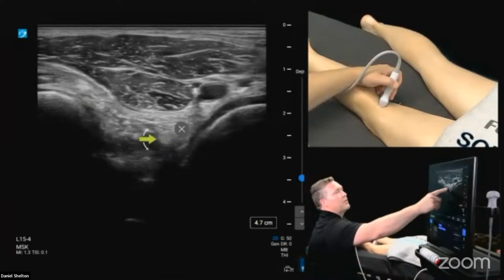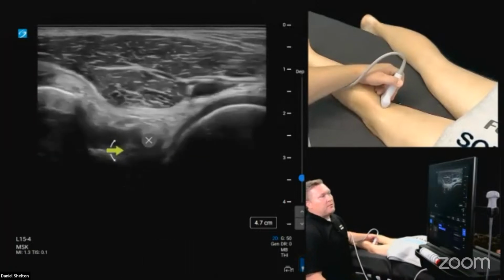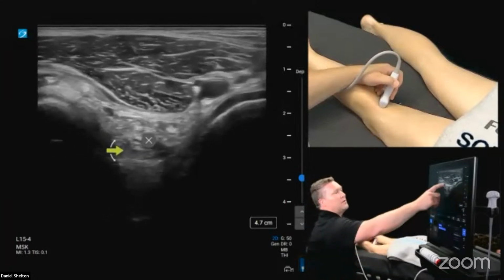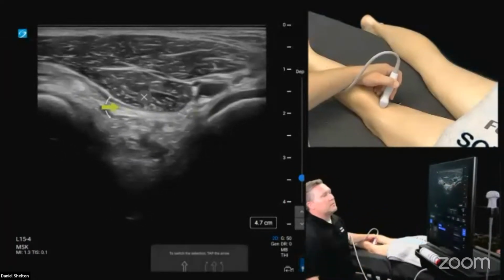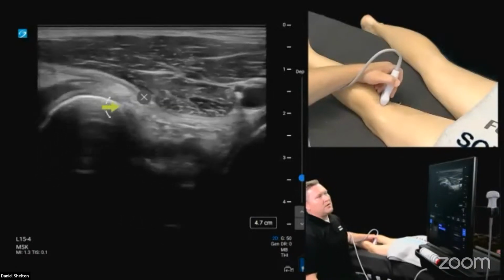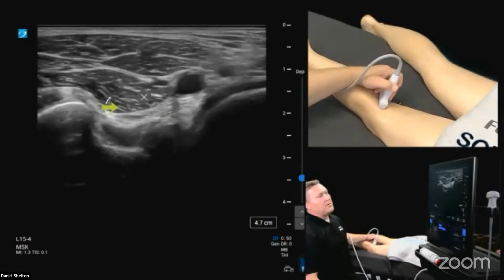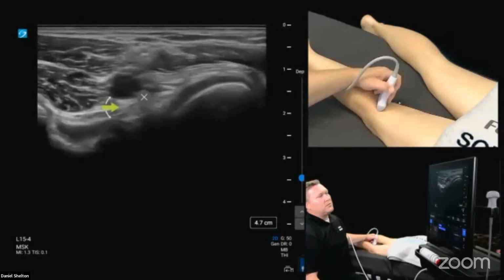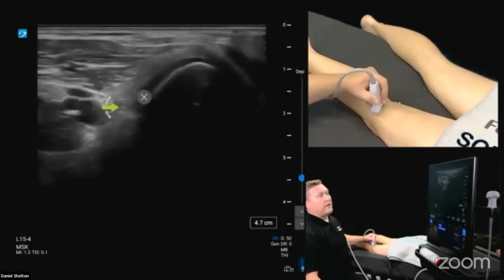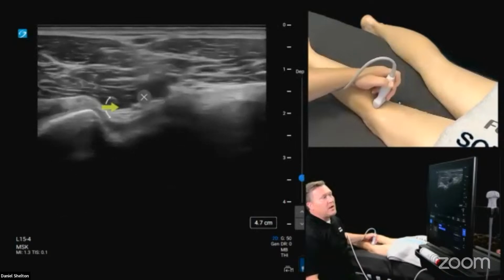And then a good landmark is this hypoechoic shadow that we went over earlier, and that's your PCL. So while you're in the neighborhood of the PCL and you look just superficial to the PCL, you catch this really, really nice, pretty ligament in its long axis, bridging the gap between the tibia on the medial side, just under semimembranosus, and then you swing the lateral side of the transducer over the lateral condyle, where this ligament eventually inserts not only onto the articular capsule on the lateral condyle, but I think most of it even wraps up and around it to its cortical insertion with the capsule. So it was a fun challenge. I thought it was neat to look at.